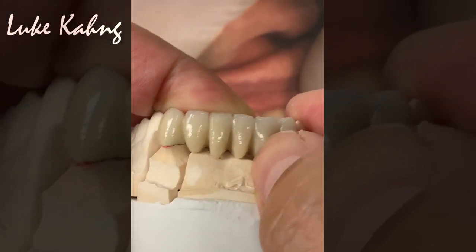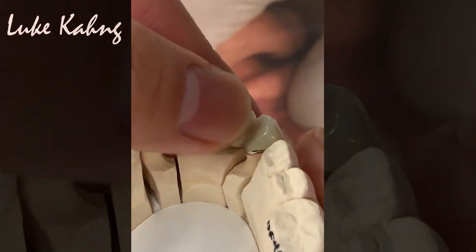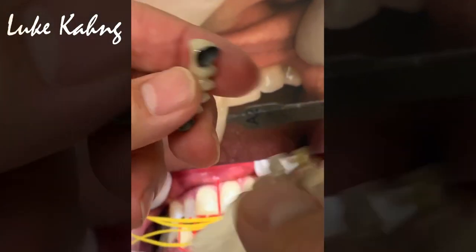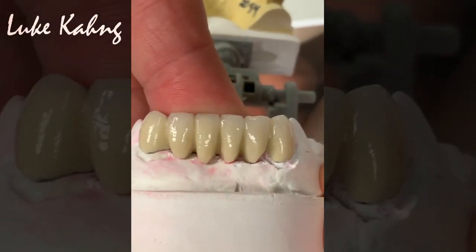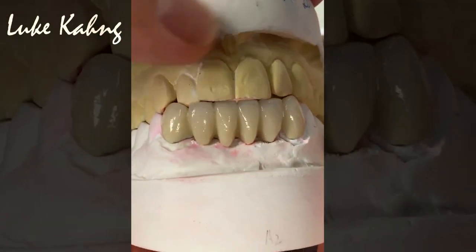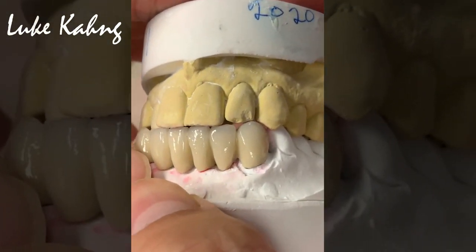Trying to make the room underneath, okay, so they can clean easily. Okay, and here is the model. So we check the solid model correctly, like this. Okay, and check the occlusion. Okay, good.